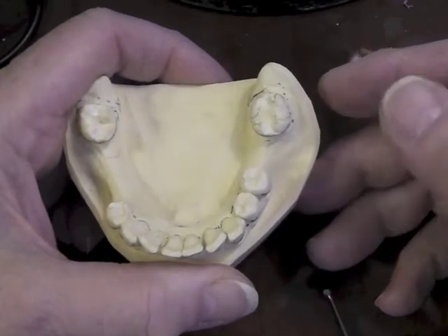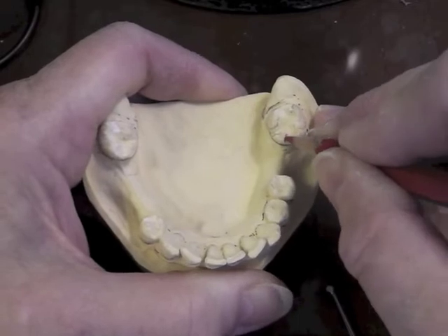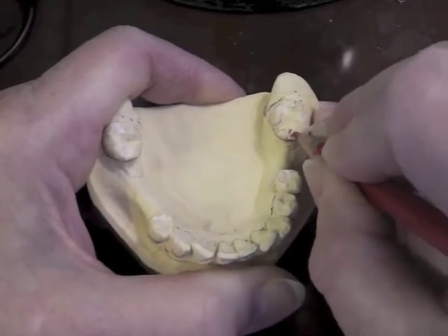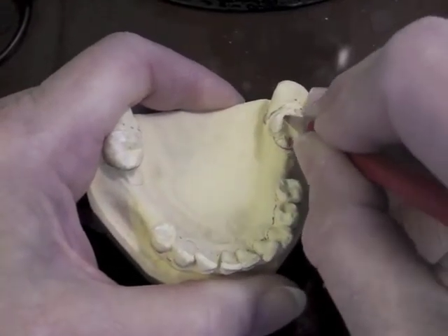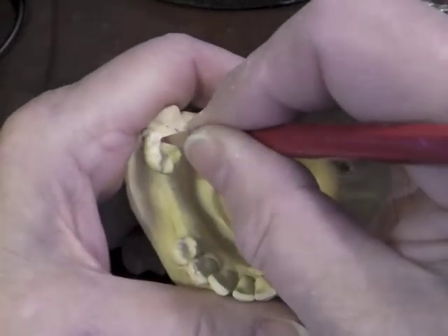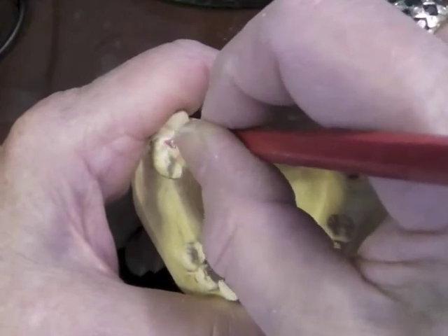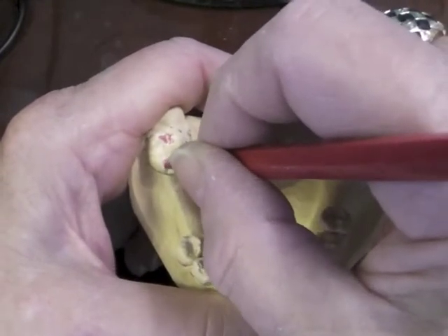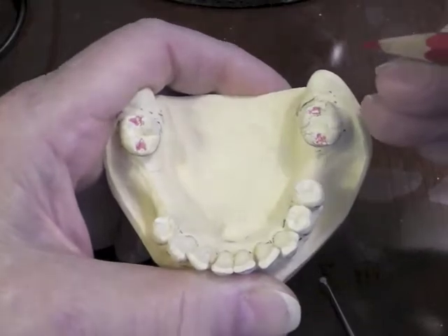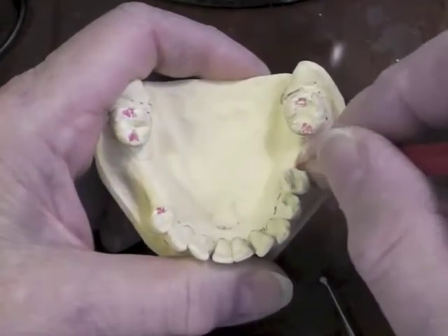Let's place our design on the cast. The first thing I would do would be to place my mesial rest, distal rest, distal rest. We're going to have to cut these, so I'm just really scribbling them in real fast to go back and cut on them in a minute.